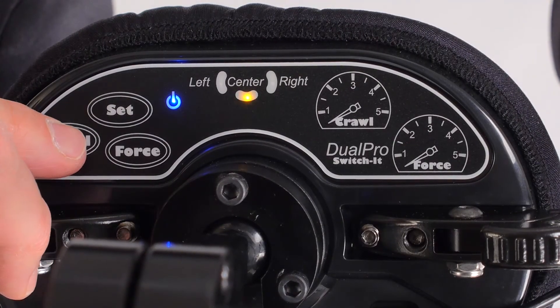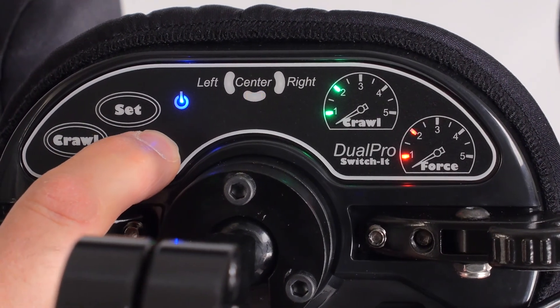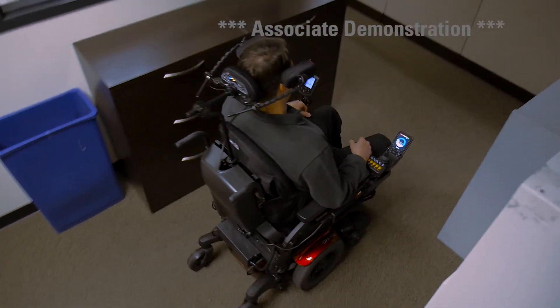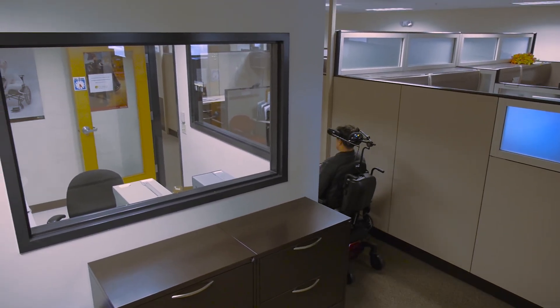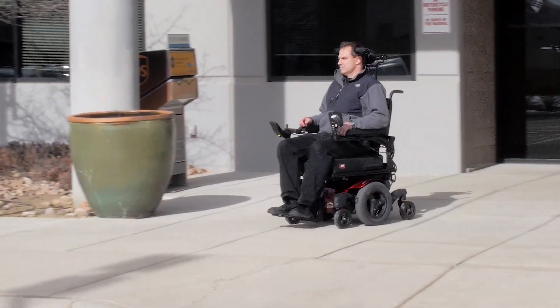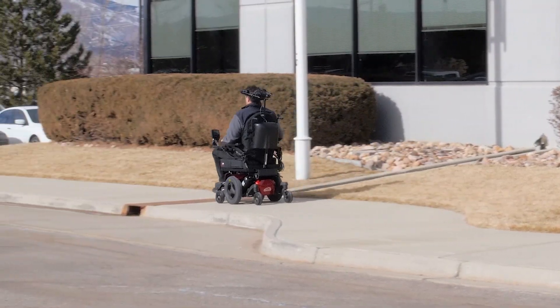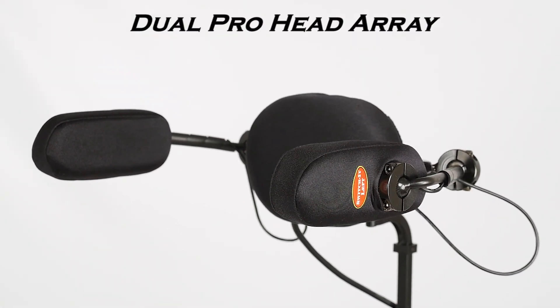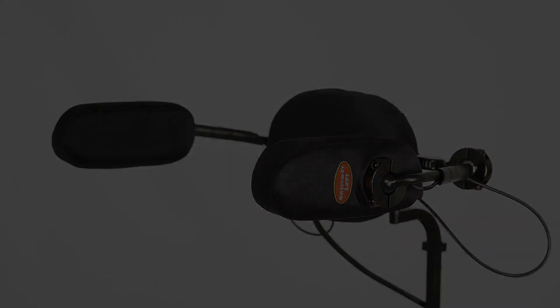Probably the most popular setup is to set the proximity, or Crawl, on level 2 and the force on level 3. This provides a nice mix of both proximity and force, so the user can easily move up to a 40% speed in a grocery store, office, or home setting. Once they are in a more open area, they can press into the head pads and achieve 100% speed without having to change profiles or modes. As the name suggests, the Dual Pro really does provide the best of both worlds.